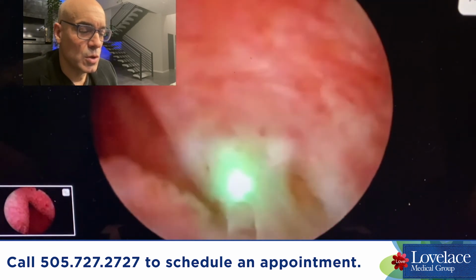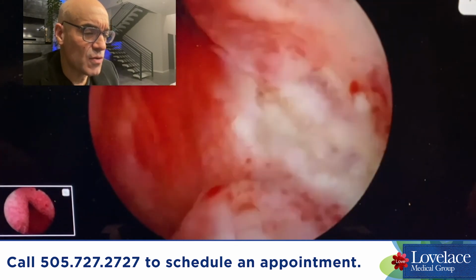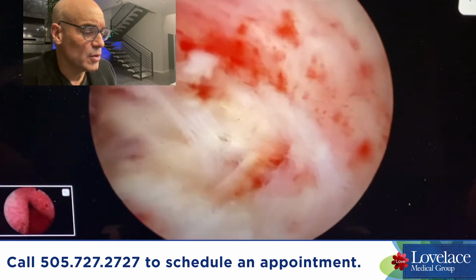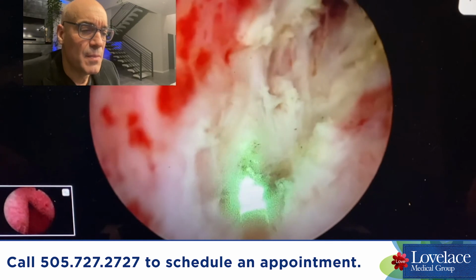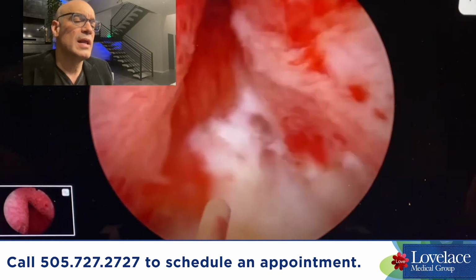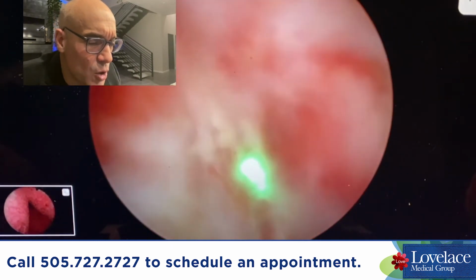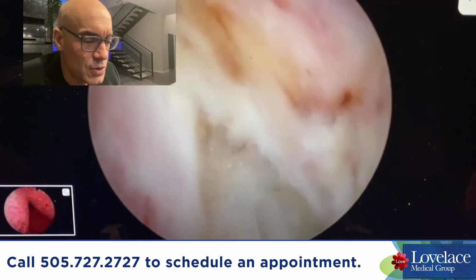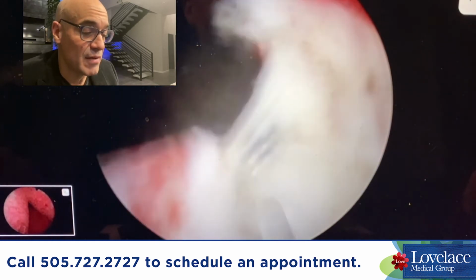So what we're looking at with this picture is the preciseness of the laser. You can see that laser energy is transferred to that tissue and cuts right through it, but the surrounding tissue blanches very little. And you can see how this laser is being used as a surgical instrument. It basically goes in, finds an avascular tissue plane, and we can exploit it and then shell out the prostate. This technique really results in quicker wound healing. Patients have great results, and minimum damage to the surrounding tissue, meaning fewer complications and side effects.